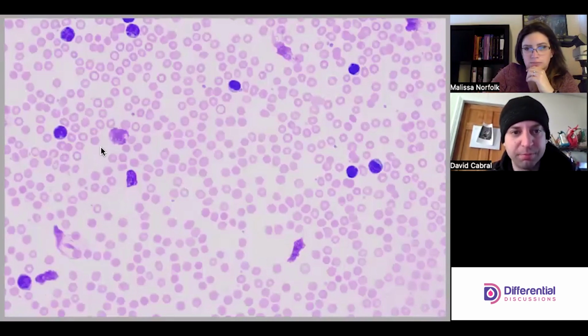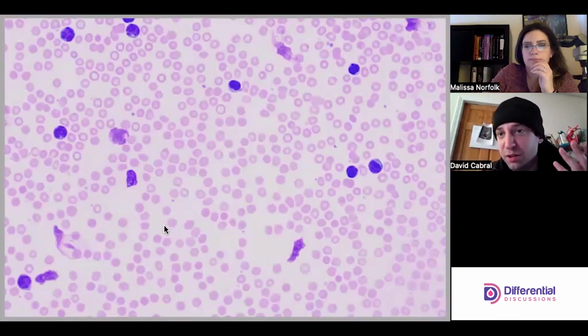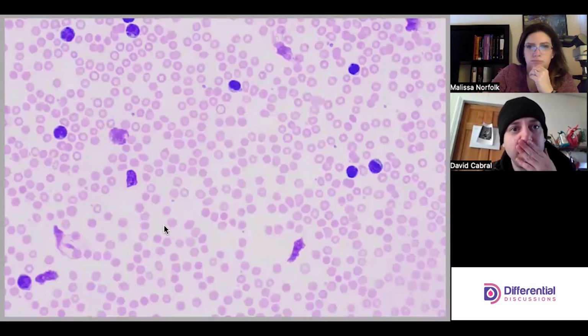Yeah. And there's considerable just in this frame, right? And it's not like we selected, this is just a random kind of area we went down to. So roughly half the nucleated cells are broken. And then you can see that the other cells in here, they're just mononuclear.